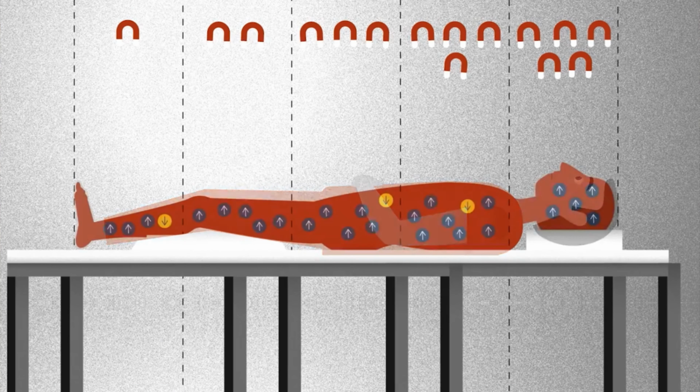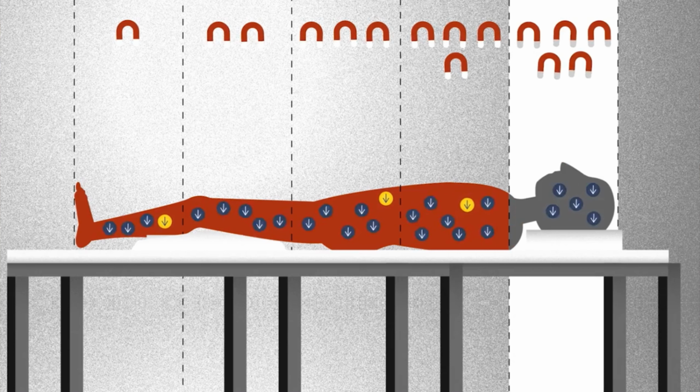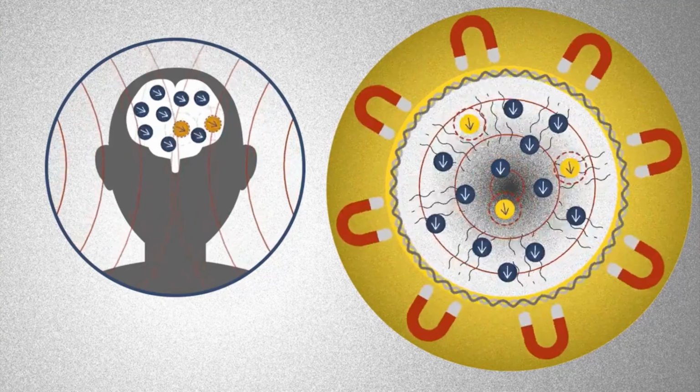To be more precise, an MRI scanner is the best way to see inside the human body without cutting it open. But how does the MRI scanner work? MRI scanners employ powerful magnets which produce a strong magnetic field that forces protons in the body to align with their field. When a radio frequency current is then pulsed through the patient, the protons are stimulated and spin out of equilibrium, straining against the pull of the magnetic field.